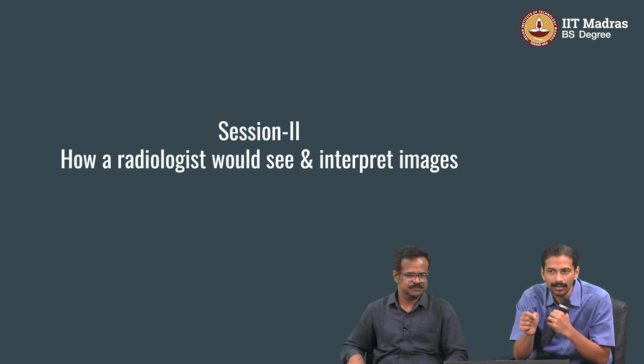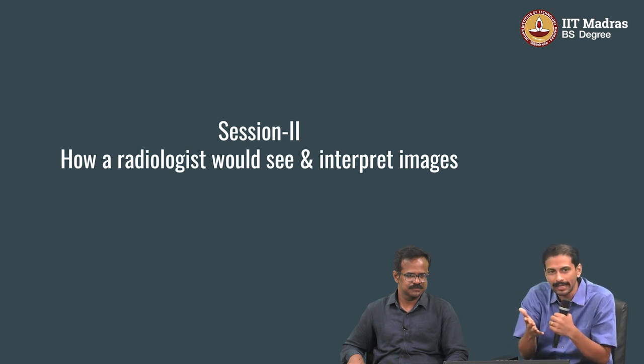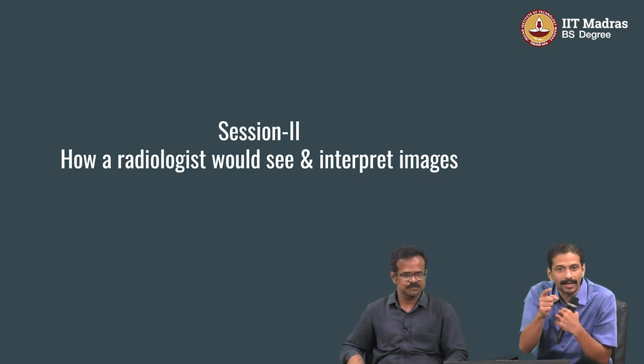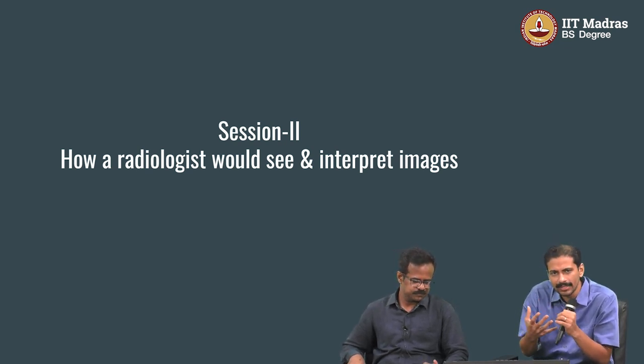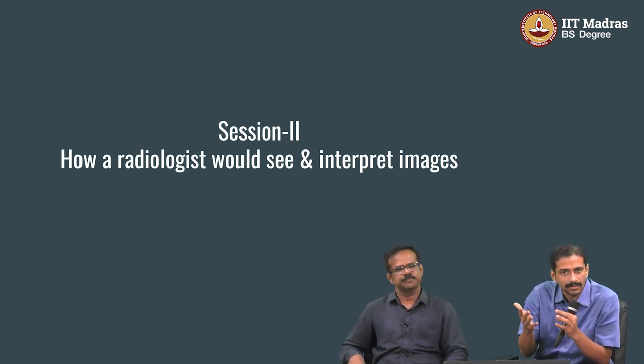What these gradients do is, when you acquire the image, they flip or change the polarity so frequently that it can induce nerve impulses. It can trigger nerve impulses. It can even cause temporary changes in ECG, some headache, peripheral nerve stimulation. So all of this can happen.